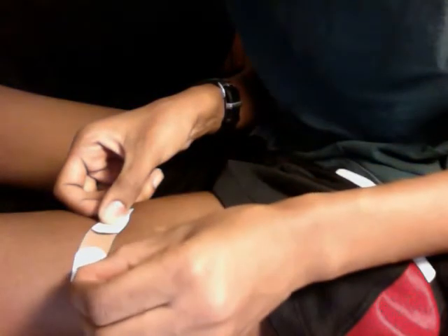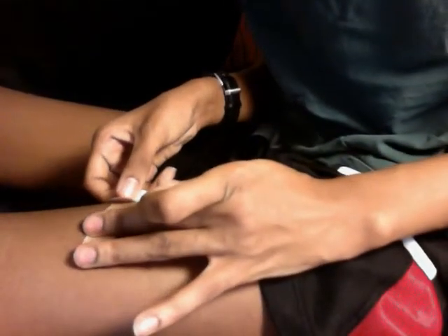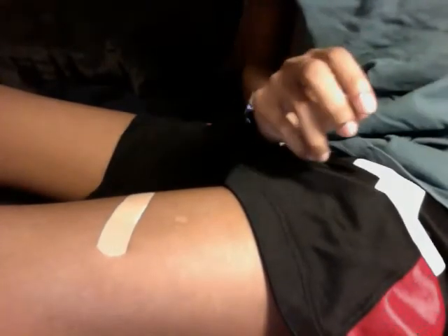Applying a band-aid. One thing I always forget to do — and I know it's important — is to pull back on the plunger just a tiny bit to see if you get a flash of red, indicating you've hit a vein or small vessel. I always forget to do it, but I've never had that happen, and I know trans guys who've been injecting for 20 years and never have either. But be sure to do that — it's one of the steps on the sheet. Alright, that was my intramuscular injection — all good to go for another week!